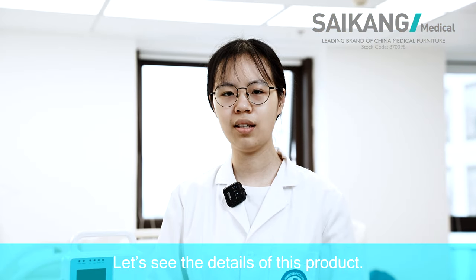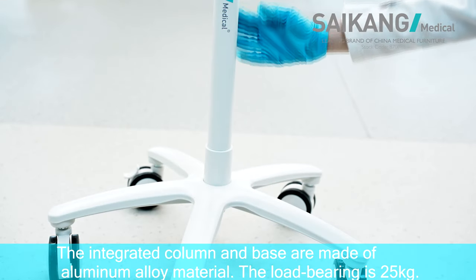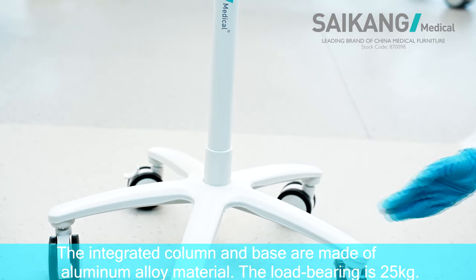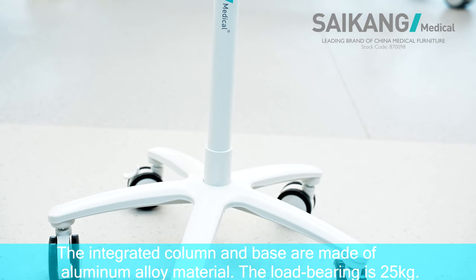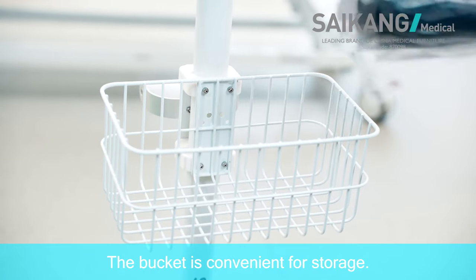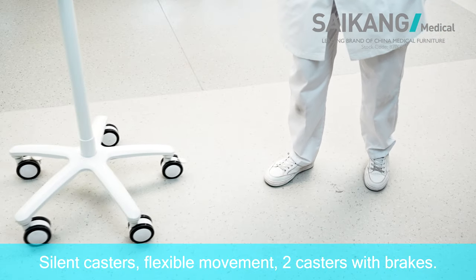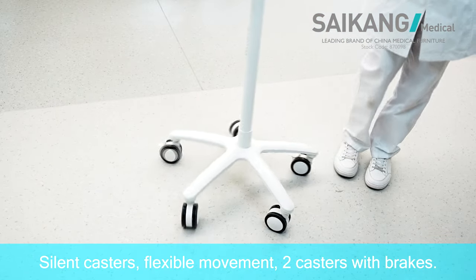Let's see the details of the product. The integrated column and base are made of aluminum alloy material. The load bearing is 25 kg. The bucket is convenient for storage. Silent casters, flexible movement, two casters with brakes.